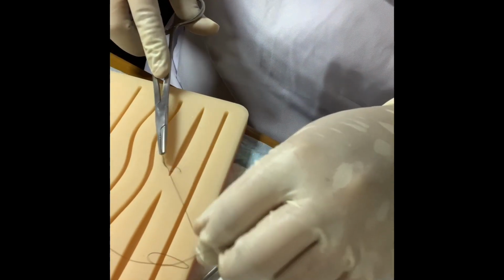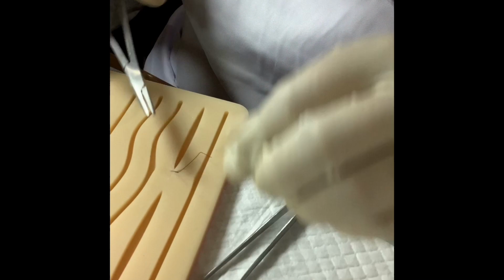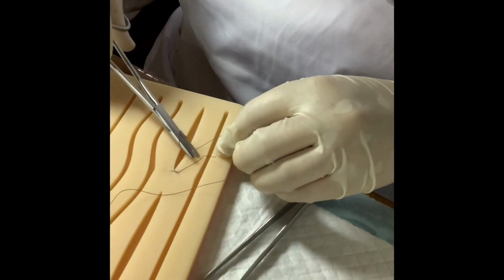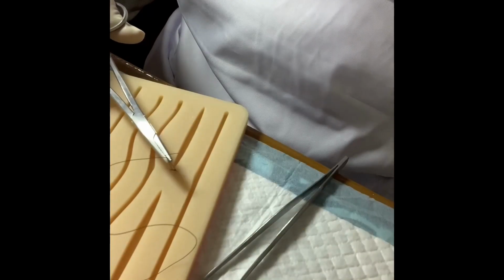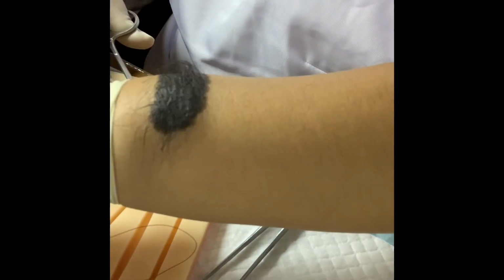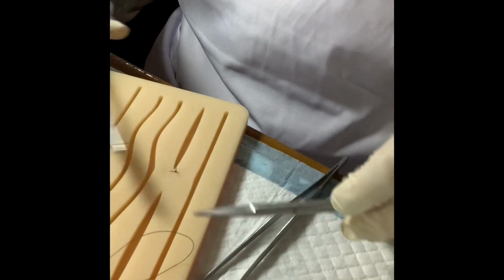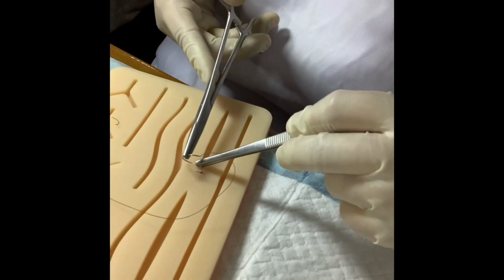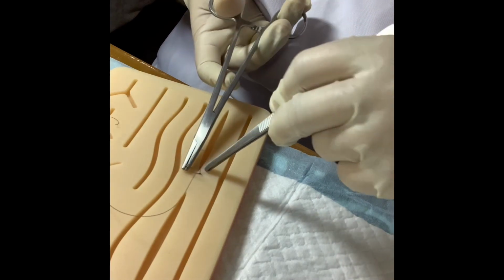Pull the suture, leaving a convenient length at the tail end of the suture. Loop the suture away from you around the needle holder twice and grasp the suture end with your needle holder. Pull the needle towards you and push your non-dominant hand away to lay the first knot. Once the knot is tied, use the needle holder to pull the knot to one side so it is not overlying the wound. Then make another suture knot to secure the suture.